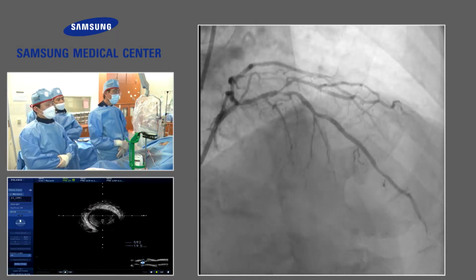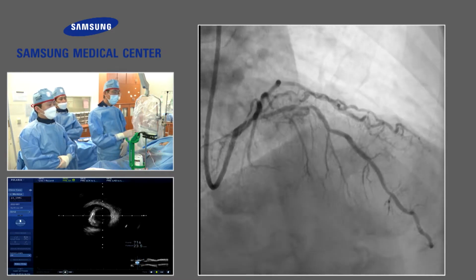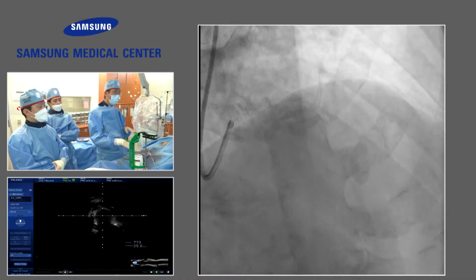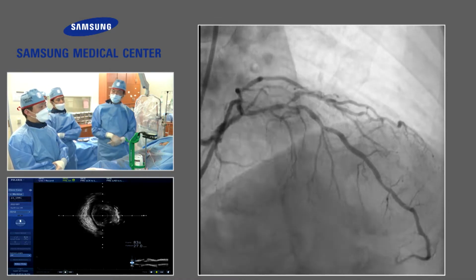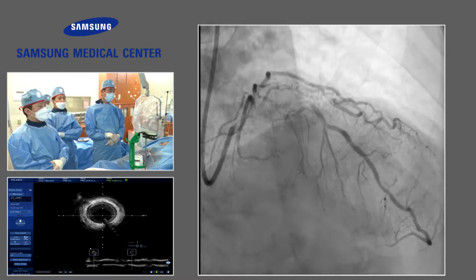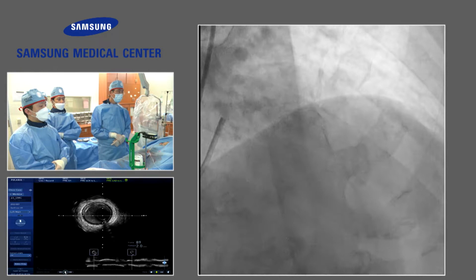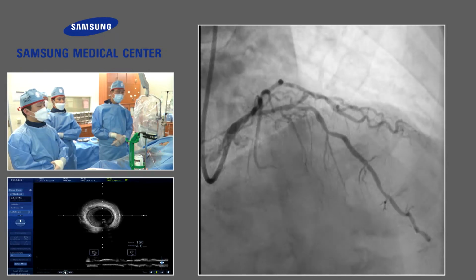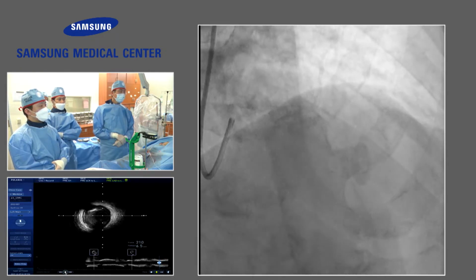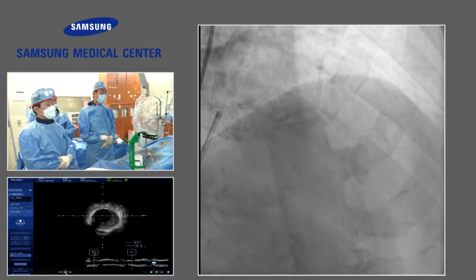Do you start from the distal or do you start from the left main? Treat the left main bifurcation, then LAD, or the opposite? What do you think? I do not clearly understand how you fixate the two bifurcations. That's the mid-LAD question: diagonal, 2 stents or 1 stent, and the left main bifurcation, 2 stents or just 1 stent?